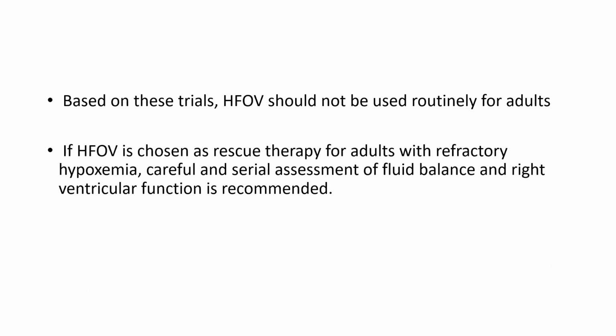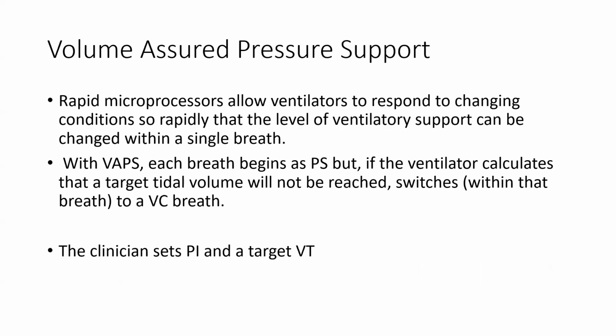So based on the trials, high frequency oscillatory ventilation should not be used routinely for adults. If it is chosen as rescue therapy for adults with refractory hypoxemia, careful and serial assessment of fluid balance and right ventricular function is recommended.